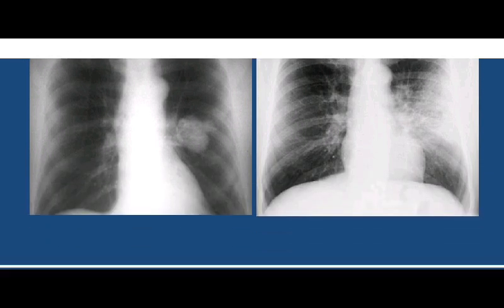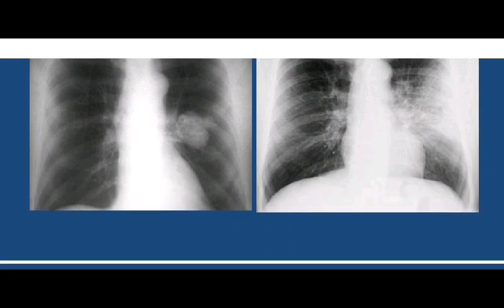It appears opaque, and this patient might be a trauma patient. Maybe due to a stab or a fall from a height, blood infiltrated the lungs, and now the lungs appear hyper opaque.